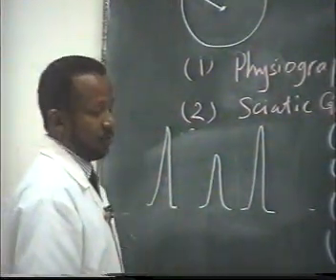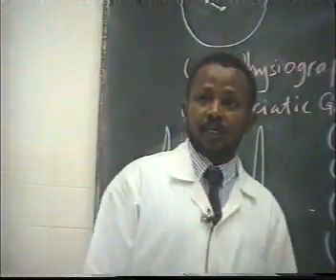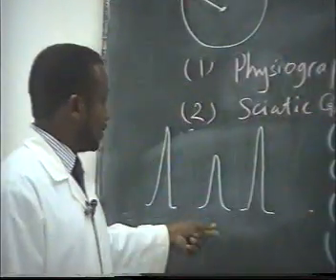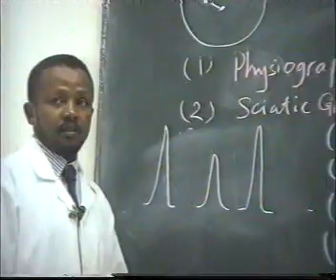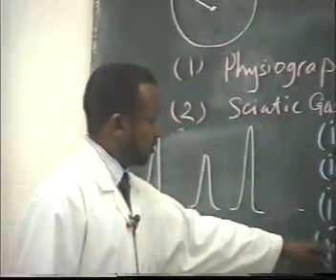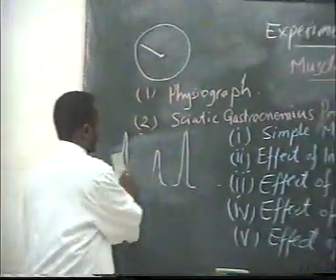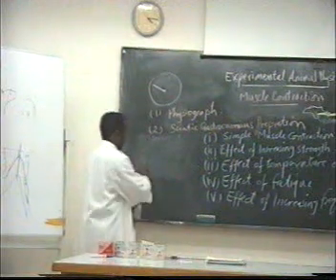This is most probably due to the effect of temperature on the chemical reactions or the enzymes in the muscle, which affects the release of energy. Also, we are going to illustrate the effect of fatigue. We are going to take a record from the muscle before fatigue.